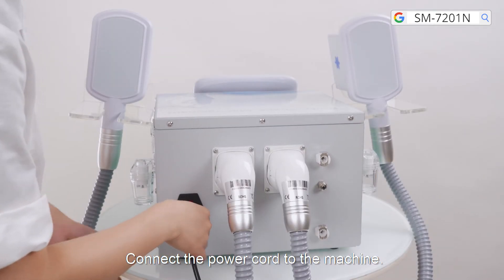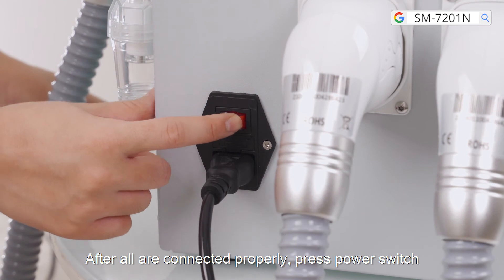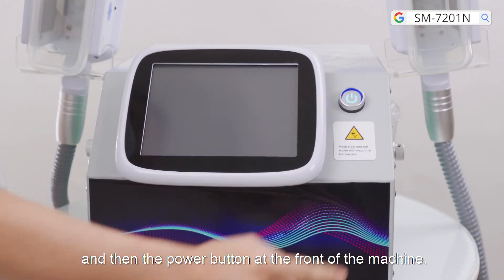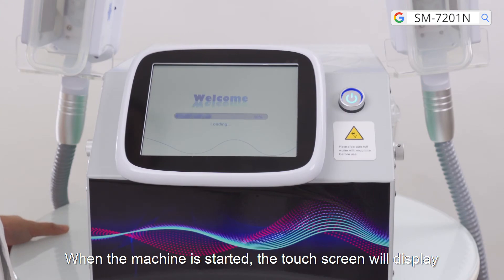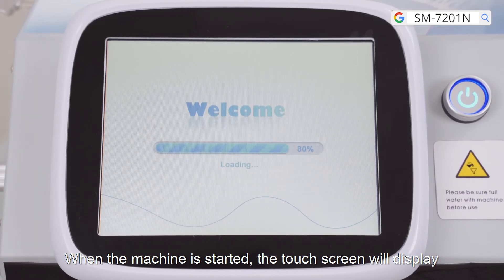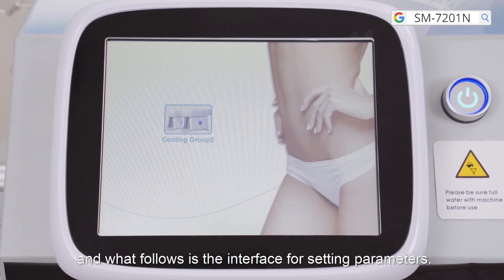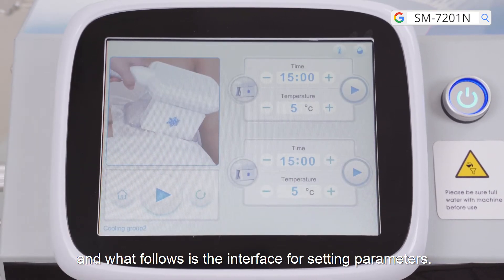Connect the power cord to the machine. After all connections are made properly, press the power switch and then the power button at the front of the machine. When the machine starts, the touch screen will display instructions on how to install the filter, followed by the interface for setting parameters.